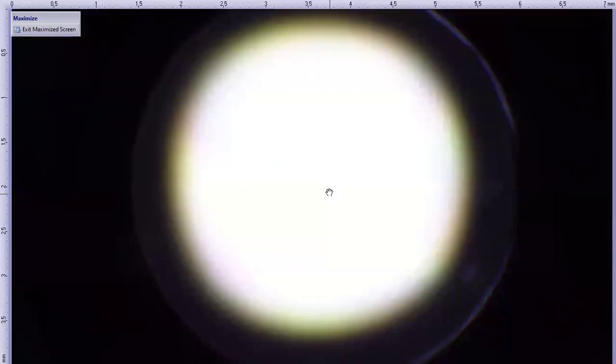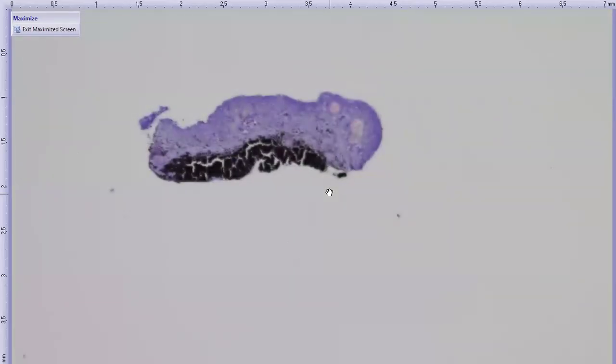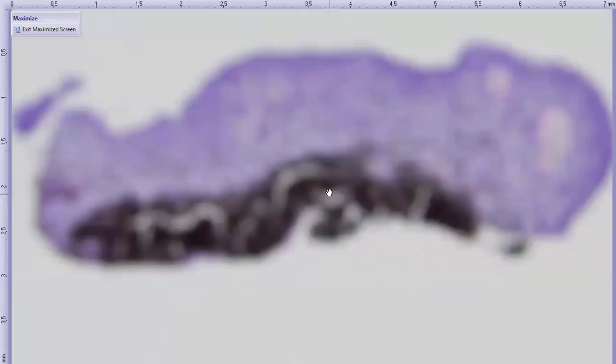We did offer immunohistochemistry, Melan A to look for the melanocytes and a CD3 and CD20 to look for T and B lymphocytes respectively. And they chose to do all three stains. The Melan A stain, just for completeness here, the Melan A that was run was a red chromogen Melan A stain. We will oftentimes pick that in cases where there is uveal involvement because of all of the pigment within the uvea from the epithelium and the melanocytes there.